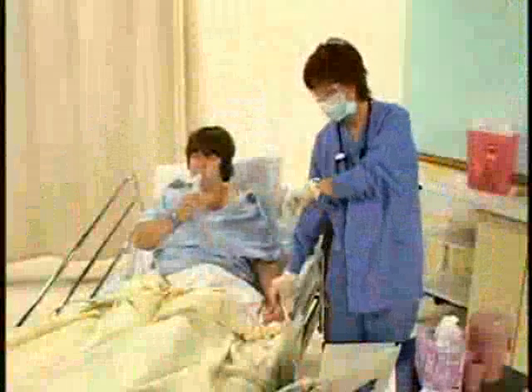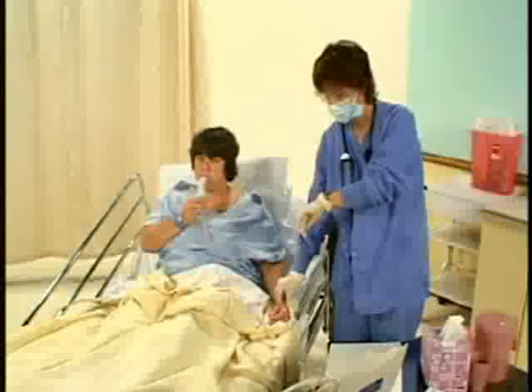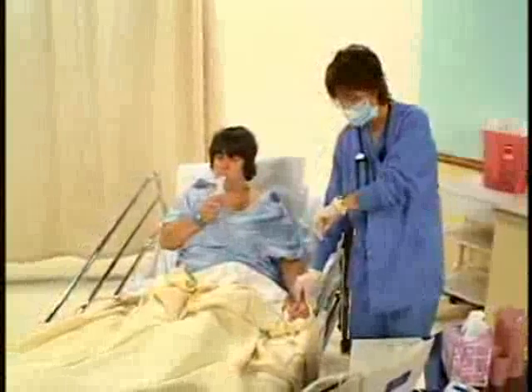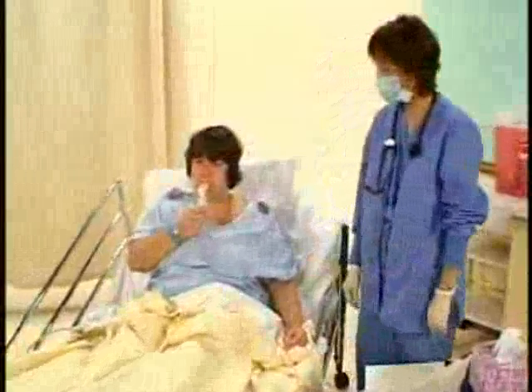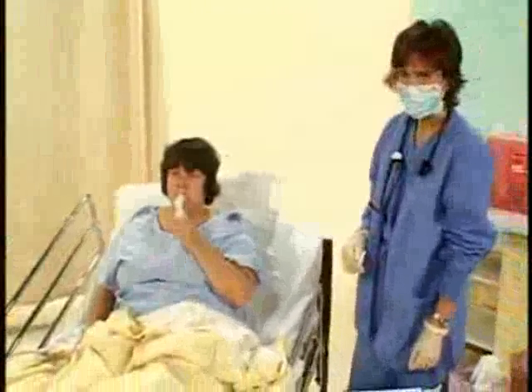Administer the entire dose of medication. This usually takes about 10 minutes. The medication is completely administered when there is no more mist being produced. Instruct the client to breathe in and out slowly and deeply through the mouthpiece or mask. The client's lips should be sealed tightly around the mouthpiece.